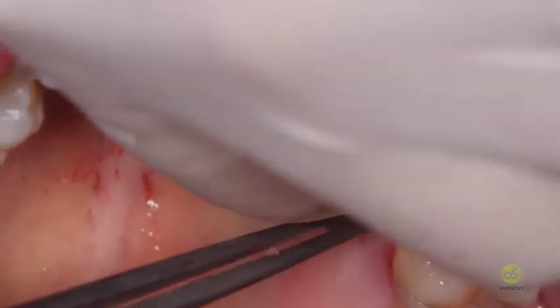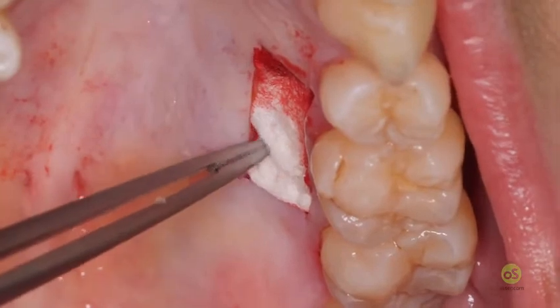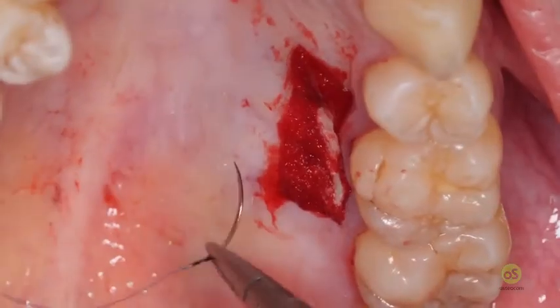You see that it's completely under control of the bleeding.